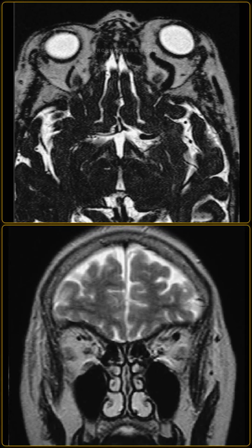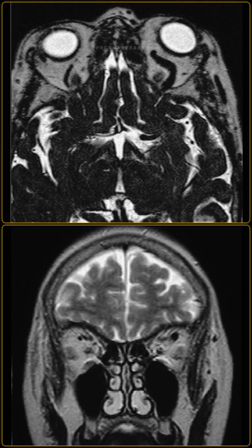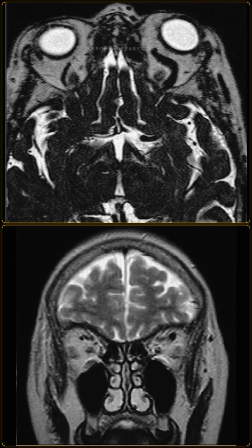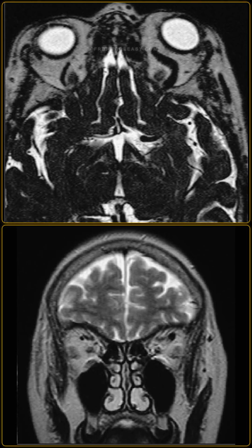As a radiologist, I would recommend immediate referral to an interventional neuroradiologist for diagnostic digital subtraction angiography and emergency embolization to preserve vision.